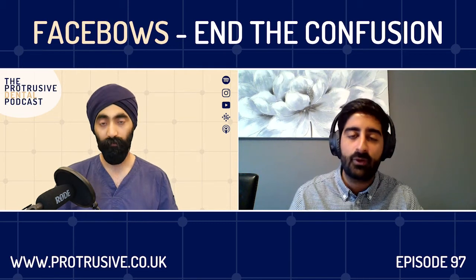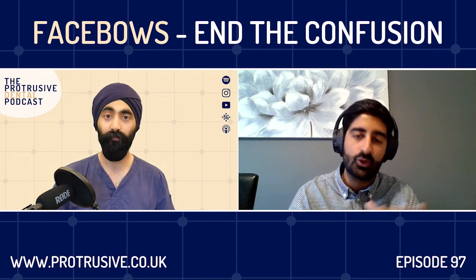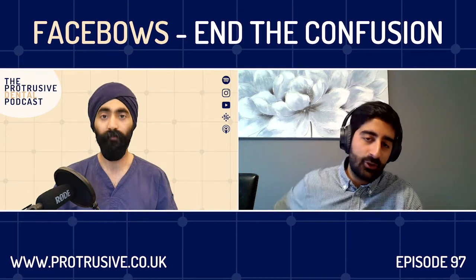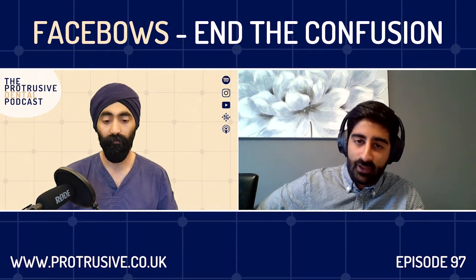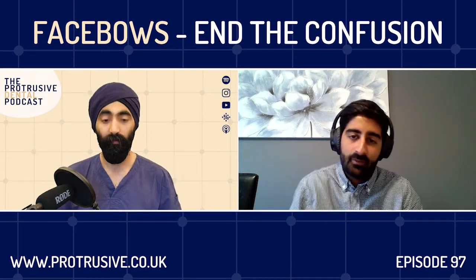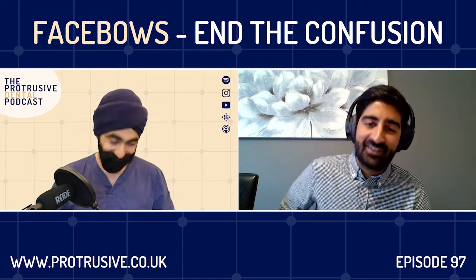And if I can give them a Facebow record, they can put it on an articulator, and then they'll know how the condylar guidance works and the jaw movements work, and they can then create much more stable restorations for me. So multiple units, increasing occlusal vertical dimension in full mouth reconstructions, and then diagnostics. That for me is my uses of a Facebow. And it's aesthetic cants, but there's easier ways.